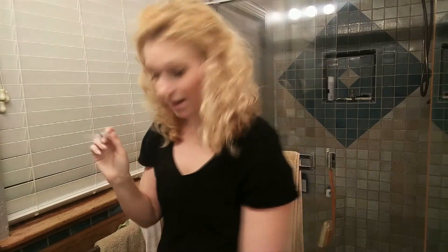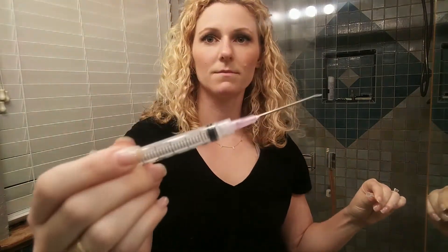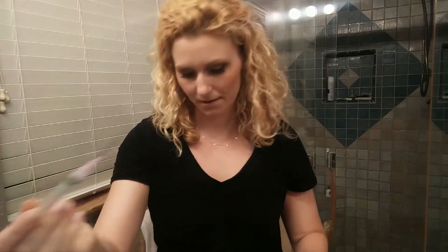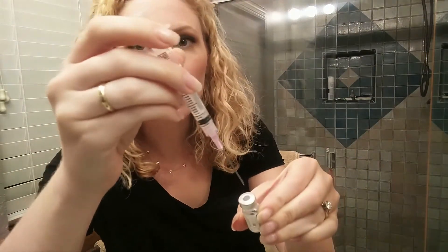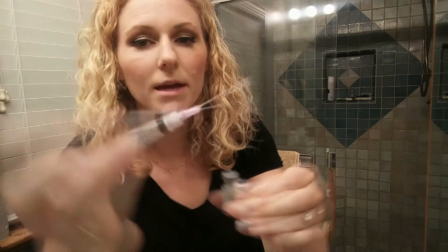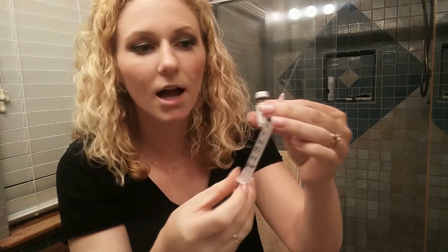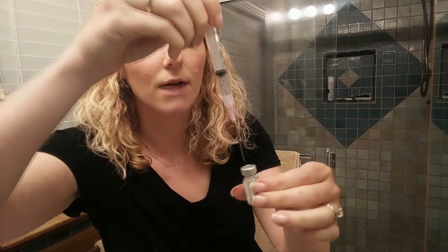Did I repeat myself? It's because I'm making sure I know what I'm doing. You gotta pull some air into that syringe — that's one milliliter right there — because it makes it way easier to pull out the liquid.